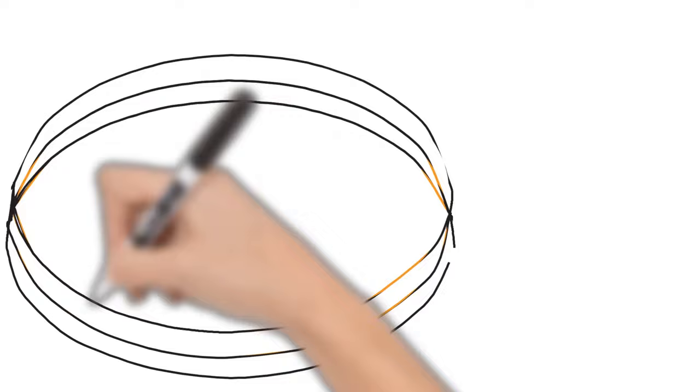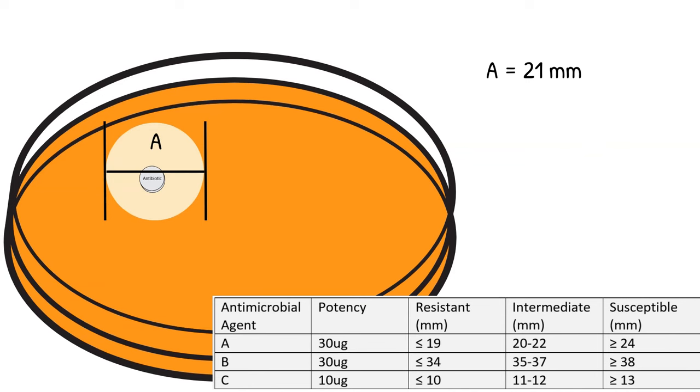Let's look at the first sample, Disc A. It looks like 21 millimeters to me. Let's write it down and take a look at the table. Disc A, 21 millimeters falls in intermediate range.